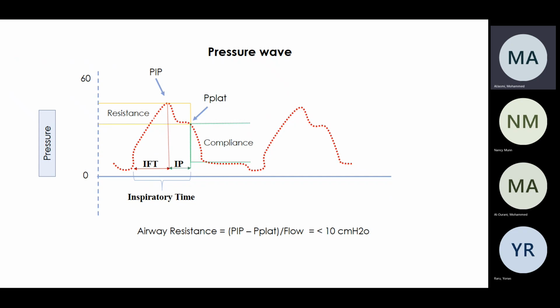There are two ways. In some mechanical ventilation modes you have to change the inspiratory time, and that will change the flow. That's the new one. Yeah, you change the inspiratory time, and that will make your flow. Every ventilator has a flow, it's just how it shows it to you. Some of them you can change and some of them you have to go find it. They all have flows. All right, so that's resistance.